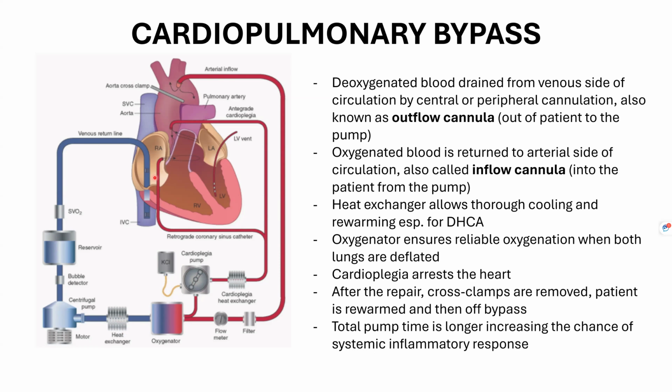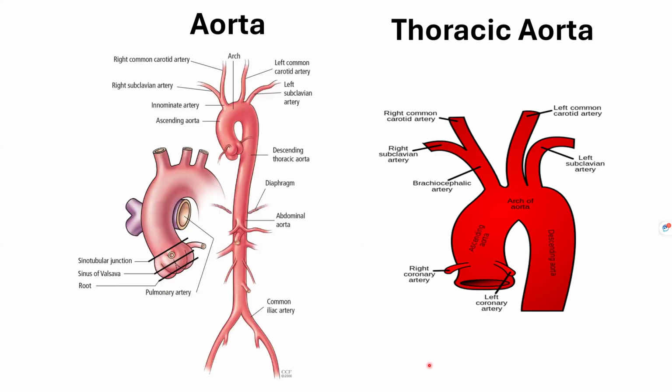And the whole surface area of that artificial surface for the blood is pretty big. There's a lot of tubing, a lot of different machines, parts of bypass machines. So it's really a big exposure of surface area.